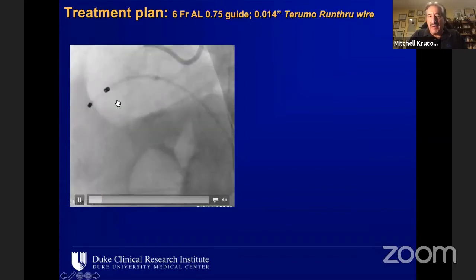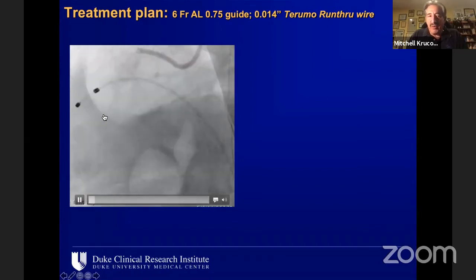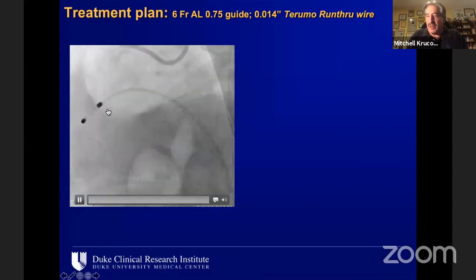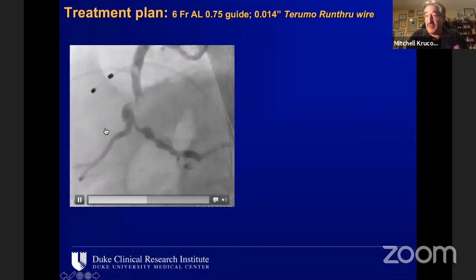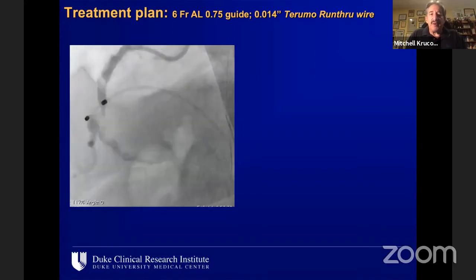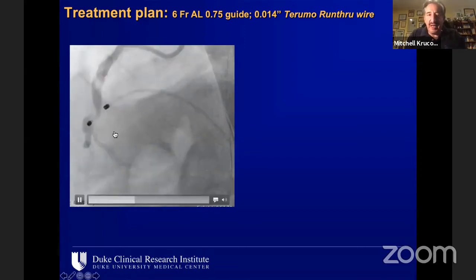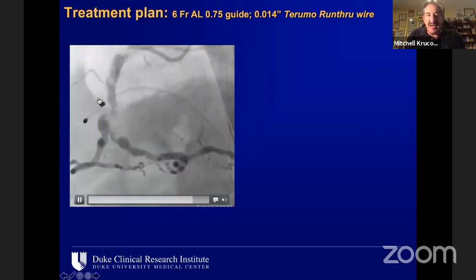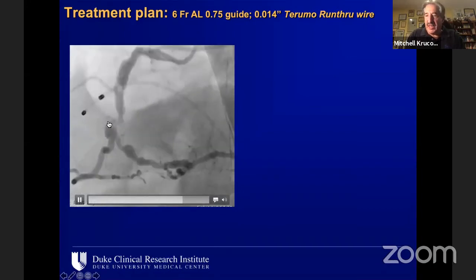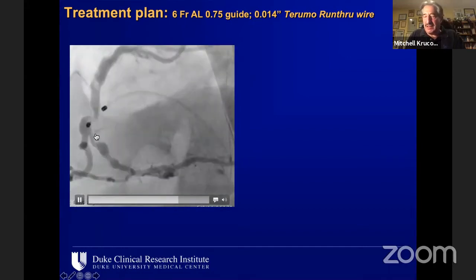But what the orbital allows us to do, as I'll show you, is not just to do atherectomy going forward, but with a wire across and with the shaft of the device across to work from distal, pulling backward, which a rotablator, of course, won't do because there is no cutting surface on the backside of a roto. But with the orbital, by pulling backward, we can ablate tissue much more aggressively in a much more straightened area, because this is not actually a bend in the right coronary at all. This is a pseudo lesion bend. So this is just all plaque, and the track through the plaque is what's bent.